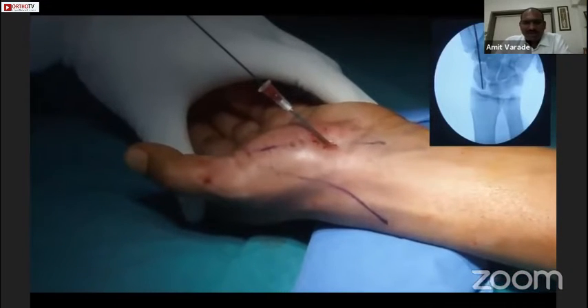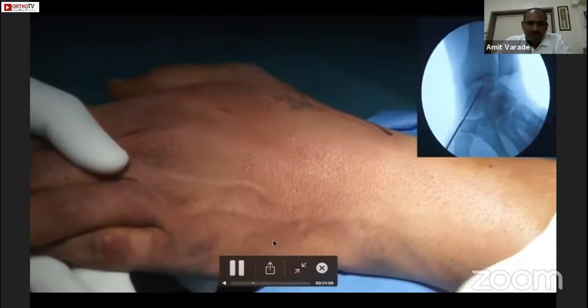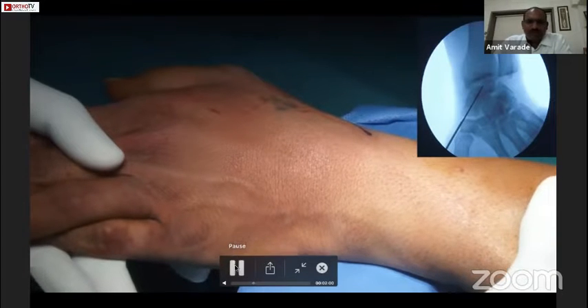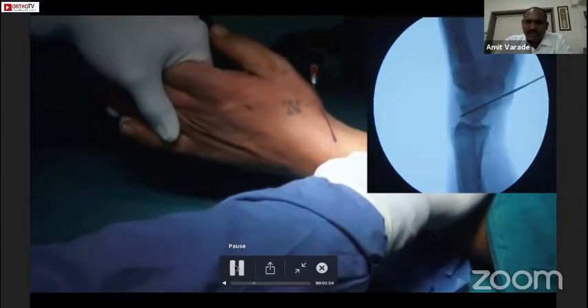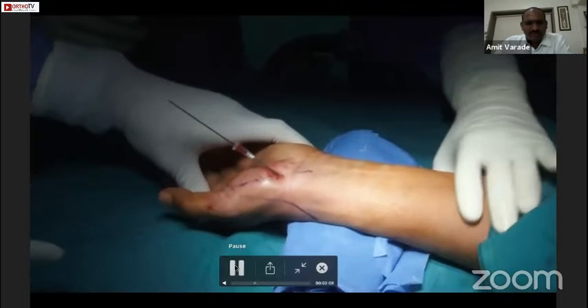Once we confirm the position, we pass the guide wire. After putting the guide wire, we should check its position in three planes: the AP plane, the pronated oblique view, and the lateral view. This is the pronated oblique view and this is the lateral view — the wire is inside the scaphoid.